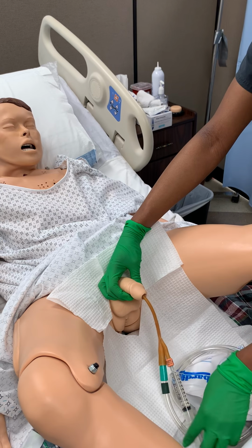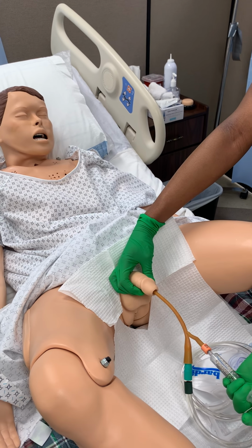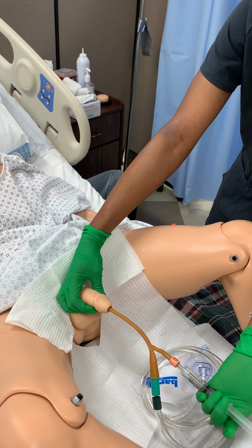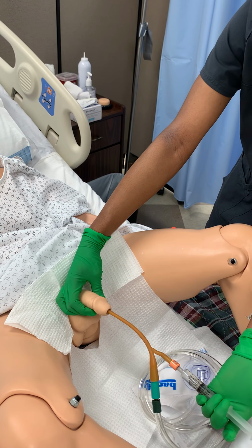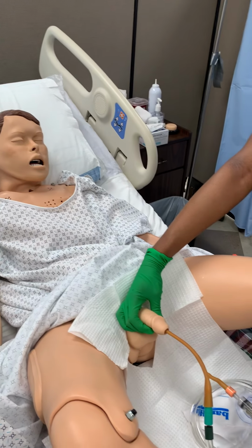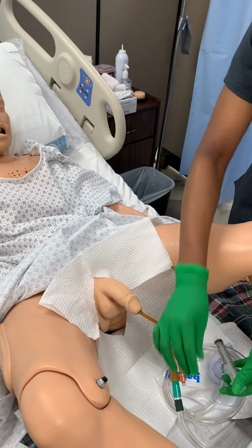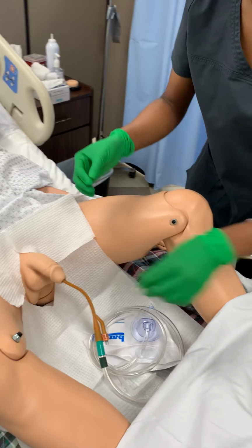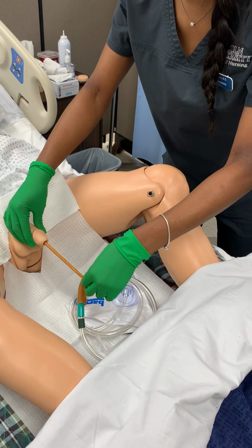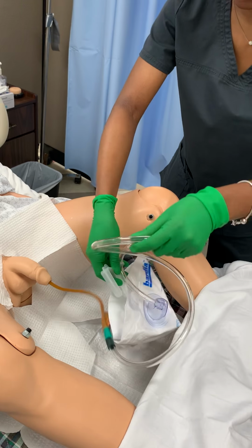Now that I'm in, I'm going to push in the 10 cc's to inflate the balloon. Are you feeling okay, Mr. Livingston? Okay, good. Now that the 10 cc's are inside the balloon, I'm going to pull on the catheter to see if I meet resistance, which I have, meaning that the catheter is correctly placed inside.